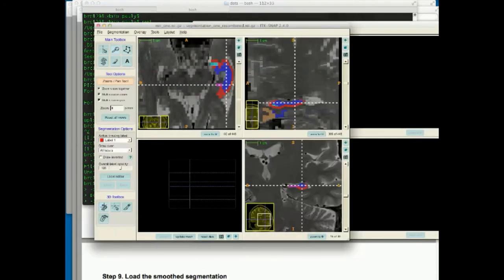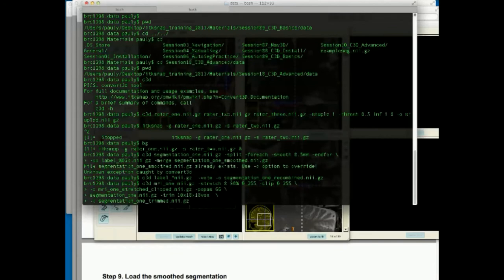Actually, we're going to do it a little later because we need both trimmed images to really look at it well. Okay, so we got the trimmed segmentation image, and now I'm going to remember it as SS. So GG for gray image, SS for segmentation. These are Paul's shortcuts.